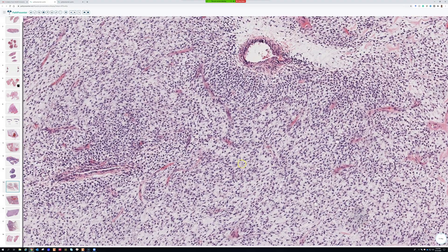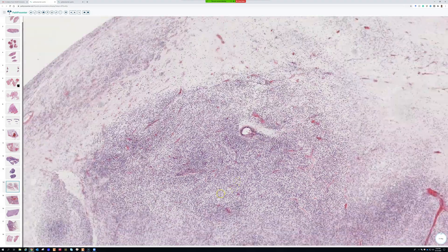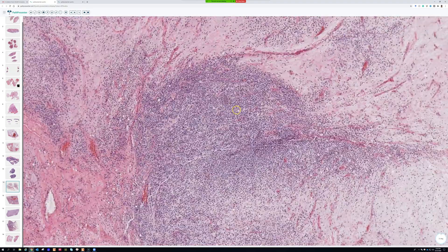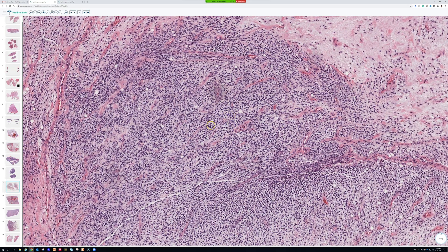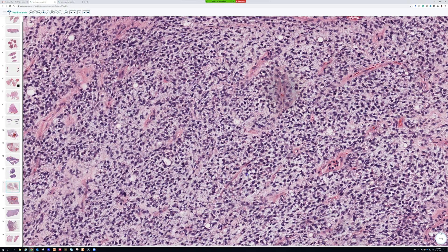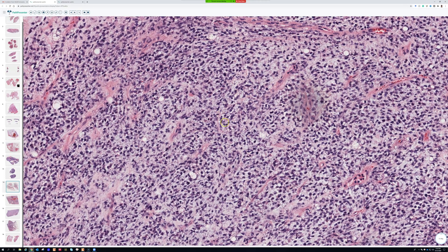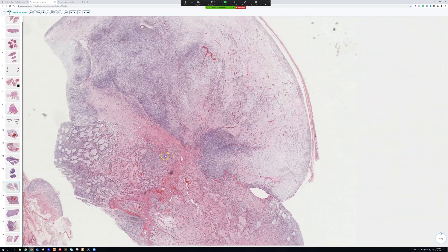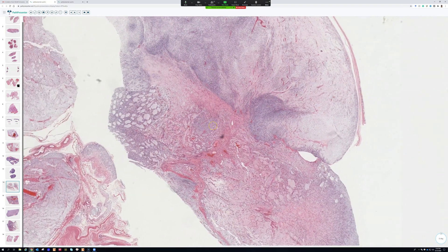There's not a solid definitive treatment difference in the literature to my knowledge, but the important morphology is to recognize those cellular round blue areas. Even when they're present, you'll usually still find the delicate vessels in the background and some component of myxoid material between the tumor cells. Keep high-grade myxoid liposarcoma in your round blue cell differential — it's very rare to get a core that's all round blue cells without any myxoid areas.